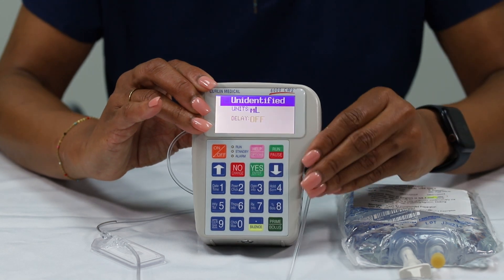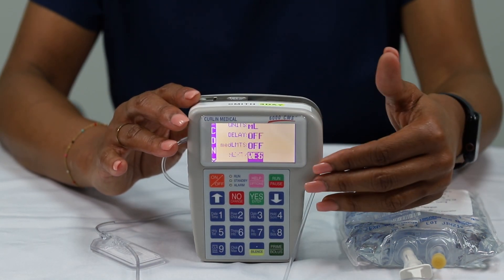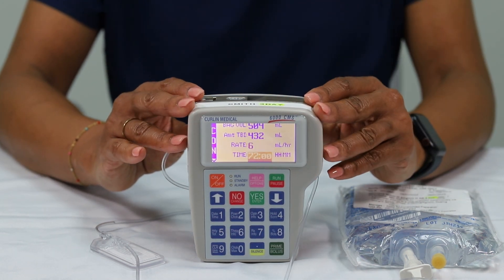Select program by pressing the green yes/enter button. Then select repeat RX by pressing the green yes/enter button. Please note: you will always select repeat RX when starting a new bag, and select resume when resuming the same bag.